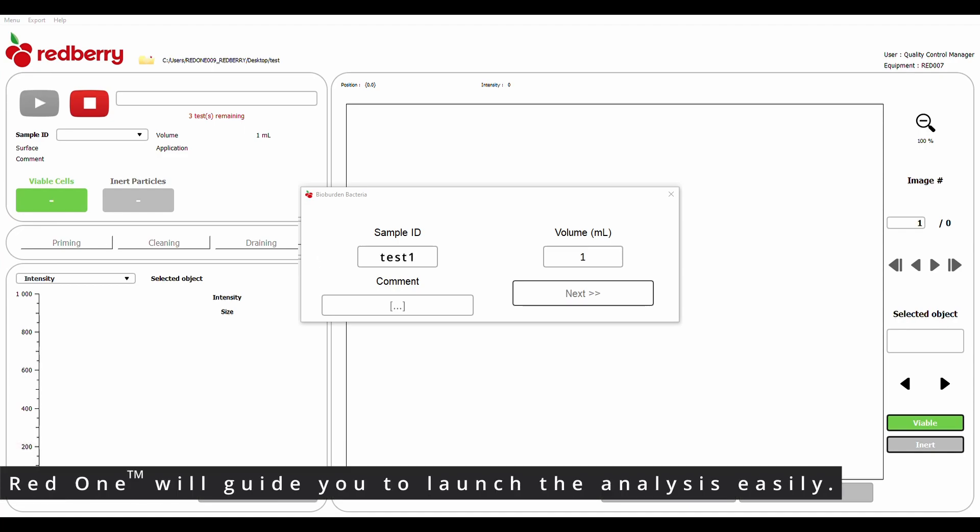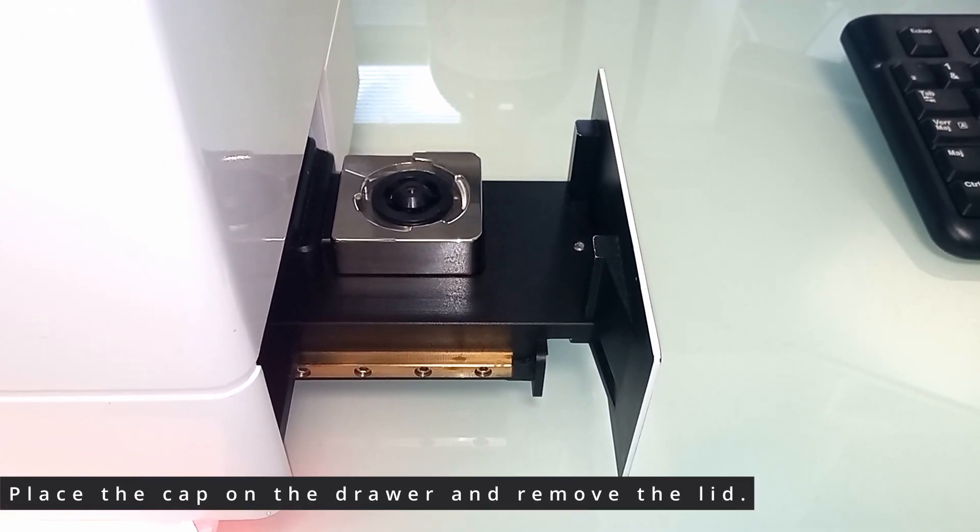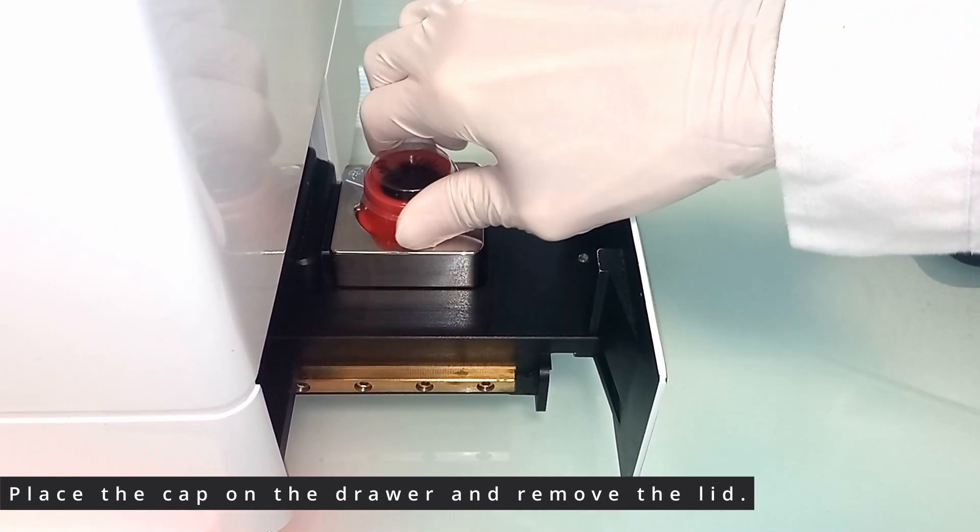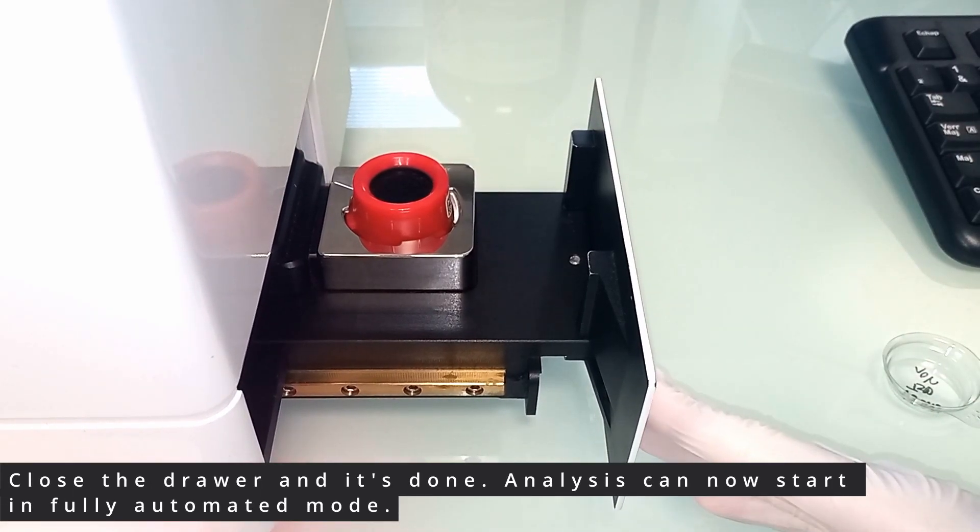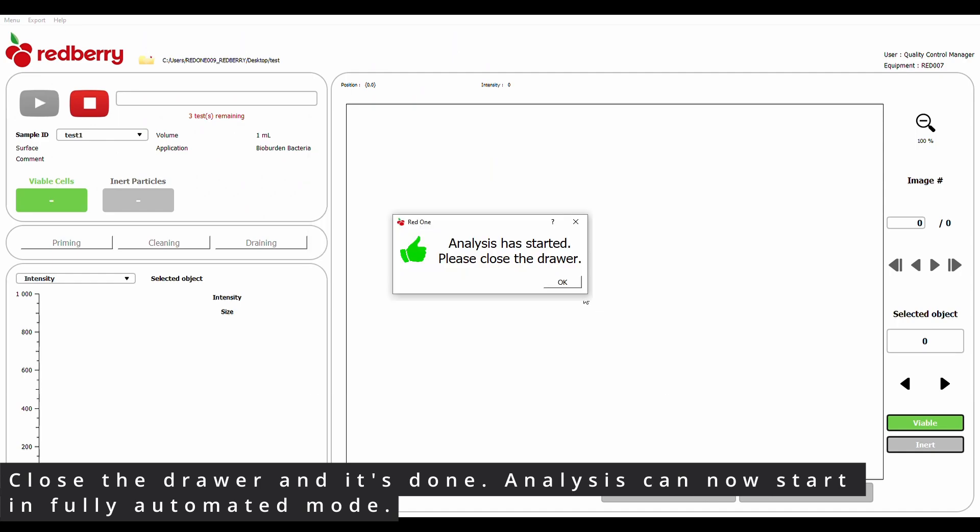RedOne will guide you to launch the analysis easily. Place the cap on the drawer and remove the lid. Close the drawer and it's done. Analysis can now start in fully automated mode.